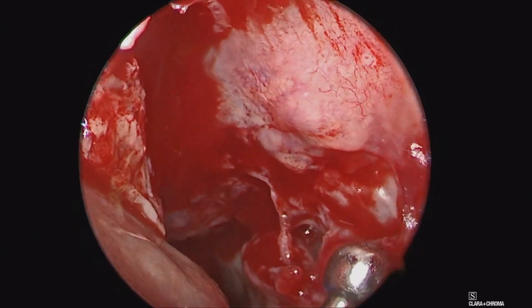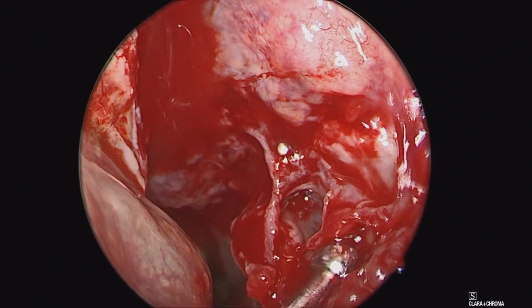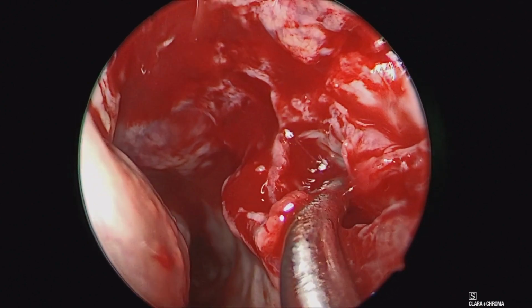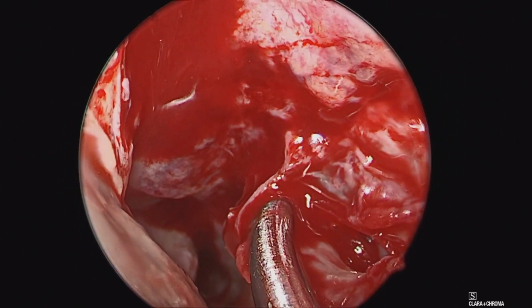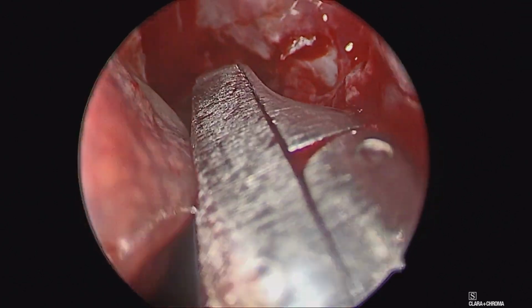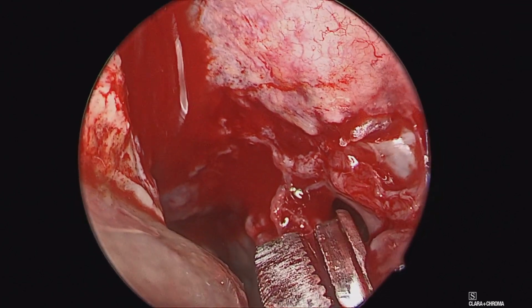After the uncinate has been removed, we've got a 30-degree scope on identifying the natural ostium of the maxillary sinus here in its classic parasagittal position. We'll dilate that posteriorly and then widely open this maxillary sinus further back with a through-cutting instrument, as you can see here.